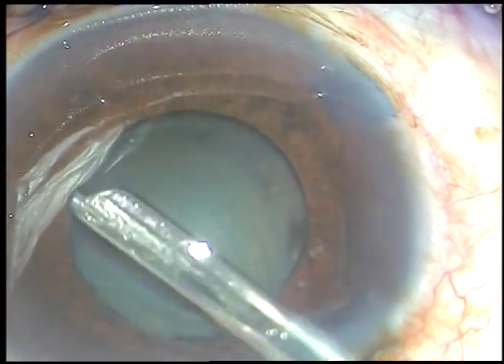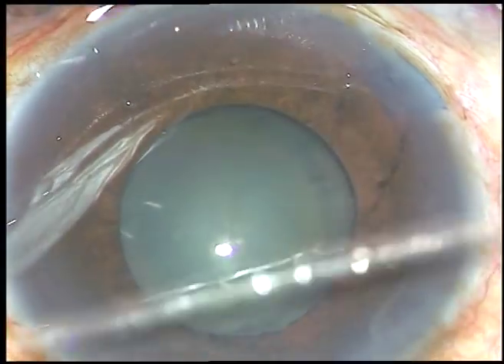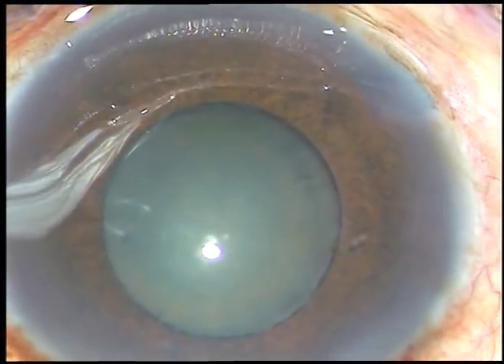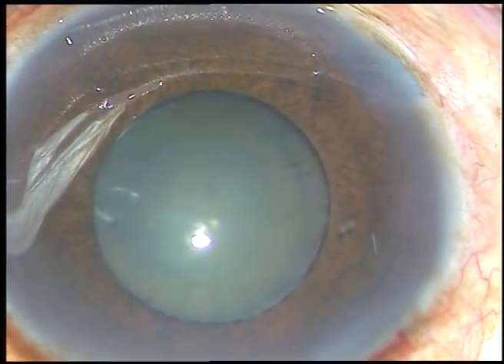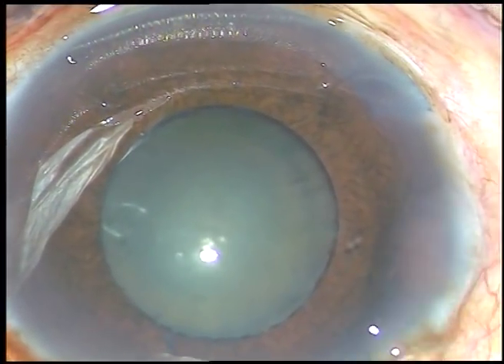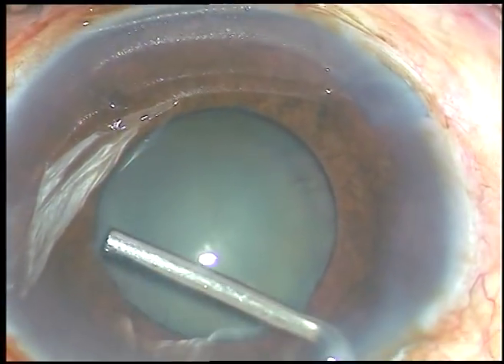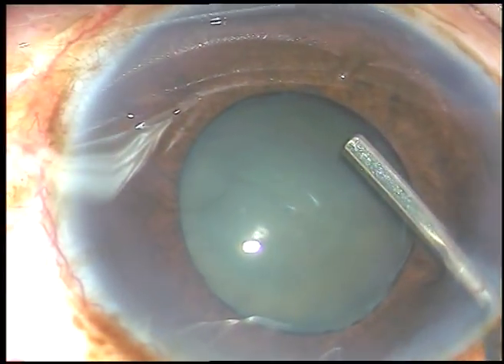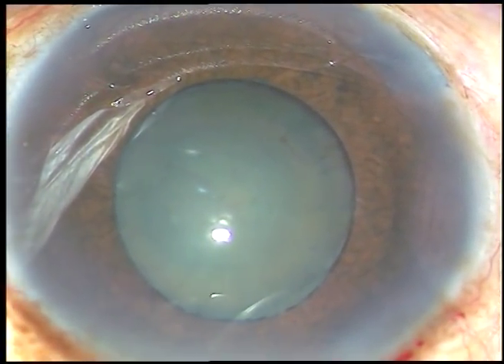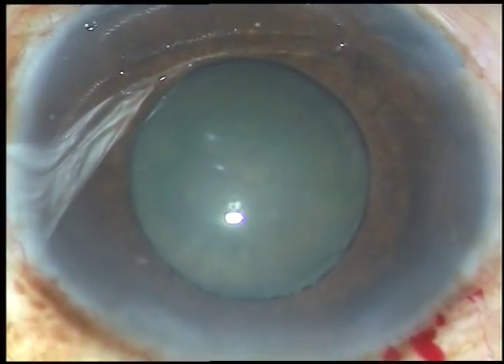In this case I am using HPMC — that is hydroxypropyl methyl cellulose — as the viscoelastic substance. I have used the SIMCO to see if there is any posterior synechiae or not. The anterior chamber is underfilled and a little bit of viscoelastic substance is injected underneath the iris to make some room for introduction of the pupil expansion device. This is a side port on the left side.